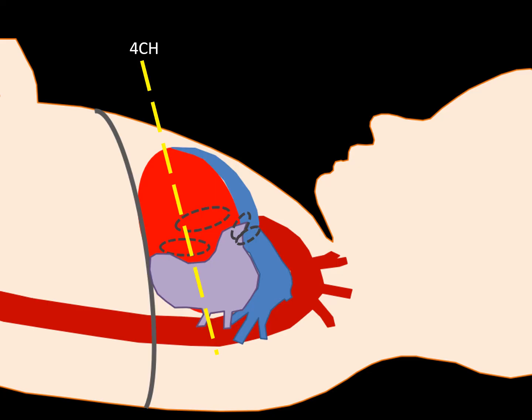And so I wanted to emphasize that here, and this depicts a transverse view just showing the fetus in a longitudinal format, but how we go from the 4-chamber view transecting the heart at this level, we're going to sweep up into the upper chest, moving the transducer some more cephalad in the fetus to show these images in the upper chest as we're moving up past the outflow and up to the arches. And this is an example of that.